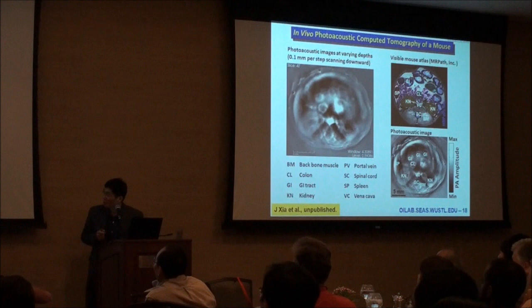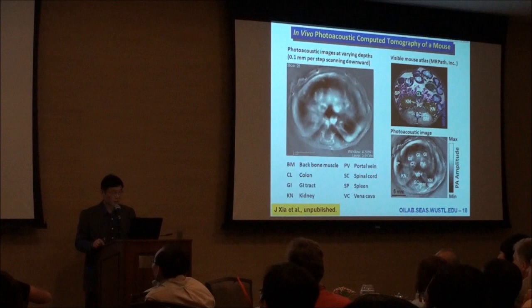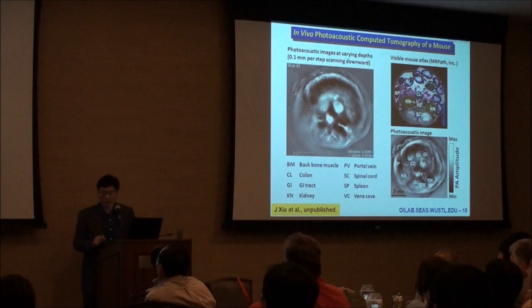In fact, our next goal is to provide you functional imaging, so we can use the color. And one beauty of photoacoustic tomography is that we see what you see with the naked eye, except you have to open up the body in order to see it. We see it non-invasively, right? And we see it beyond the visible spectrum as well. So we can use infrared light. We can even use UV light if we decide to.